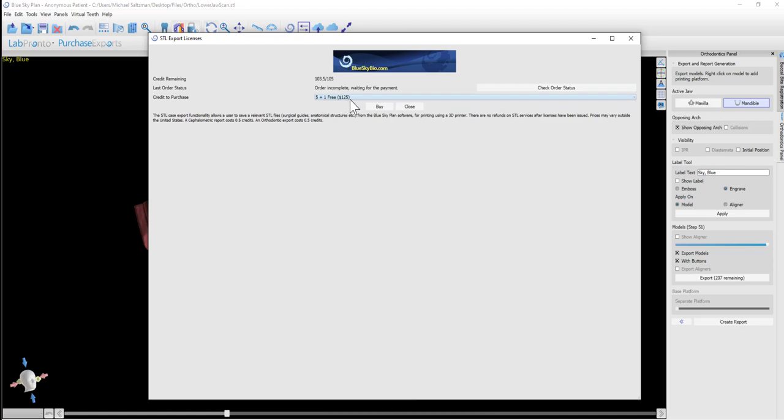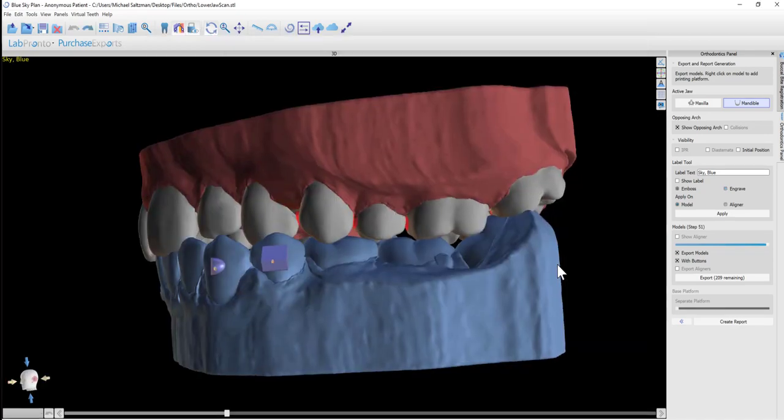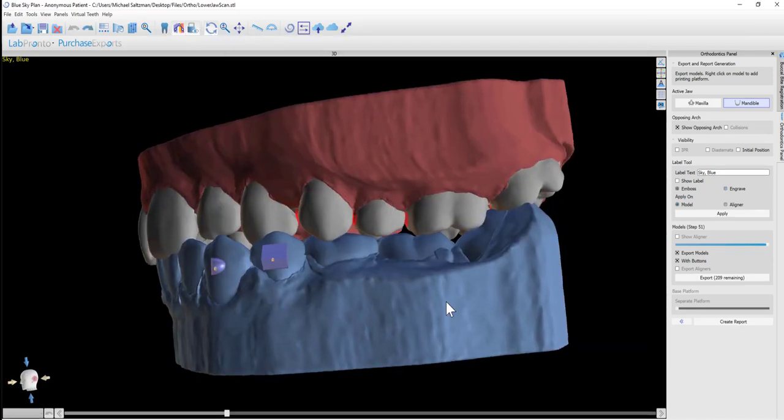So if you don't have exports on your computer, select the package size from the drop-down, click Buy, and you're able to purchase via credit card or via PayPal. Once the purchase is complete, your computer will update automatically and immediately with your new export credits.